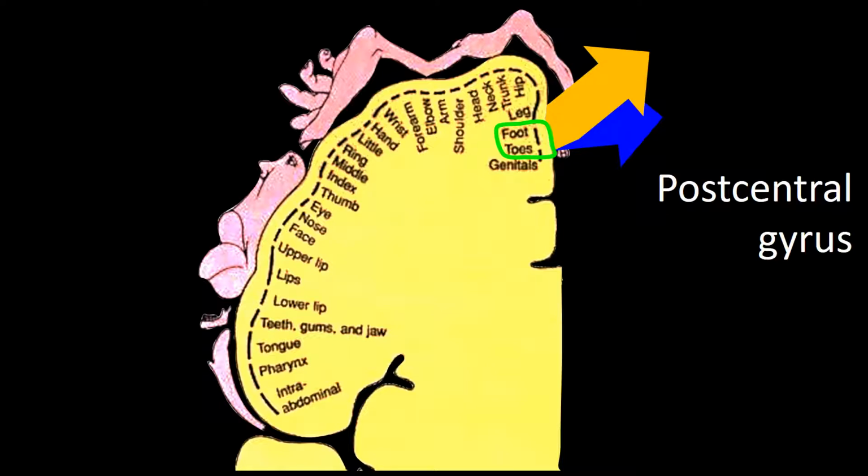At times, it tilts a little bit upwards, or frankly upwards, and rarely the vector is directed towards the same side of the cerebral cortex being activated. I have indicated this by the aqua arrow. In the next frame, I will show you an example of this variability. Here, in the lower figure, the left ankle is being stimulated, and in the top figure, the area of the cortex activated is indicated by the green lines. The vector of the field is directed contralateral to the stimulus.